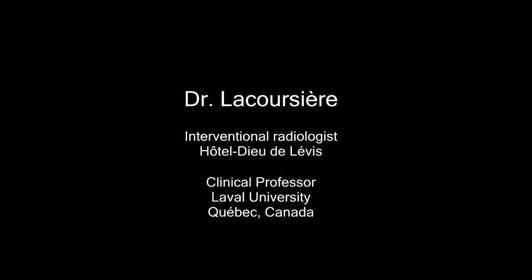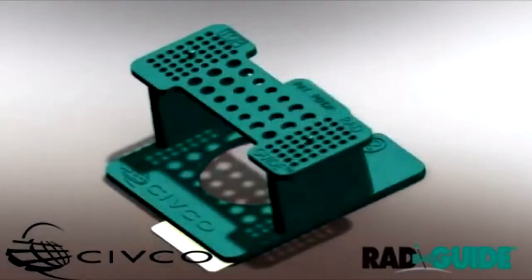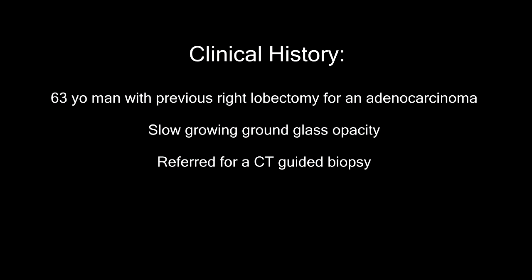I am Dr. Lacoursière, Interventional Radiologist, and I am going to present you this clinical case of a lung biopsy of a ground glass opacity, which happens to be a bronchioloalveolar carcinoma, and I'm going to be using the RAD-GUIDE device. The patient is a 63 years old man with previous right lobectomy for an adenocarcinoma.